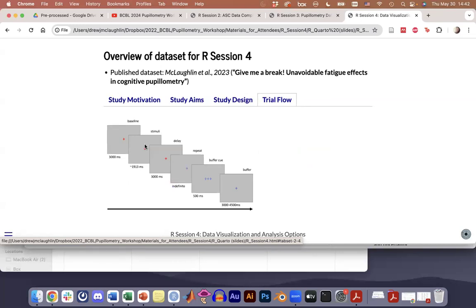And wait, that is not true, actually. Sorry. This is a speech and noise study. So we actually have the noise start during the baseline, and then a sentence plays in the middle here, which, if anyone's curious about that, I can explain in a bit more detail why we decided to do that.